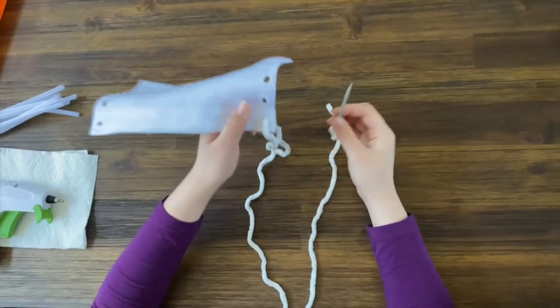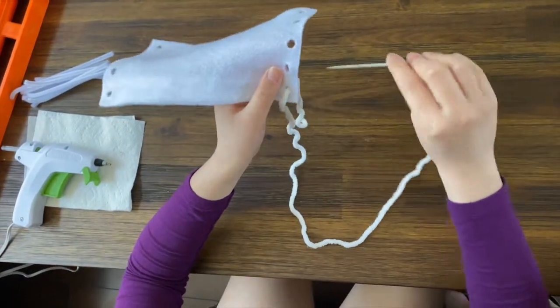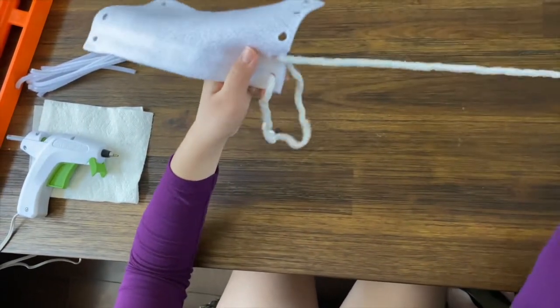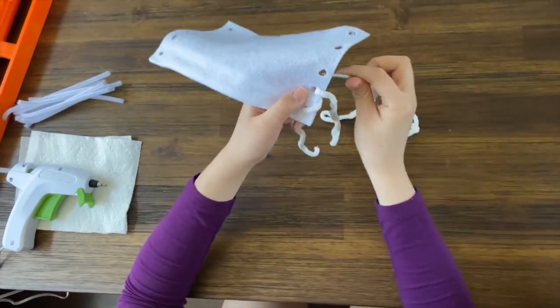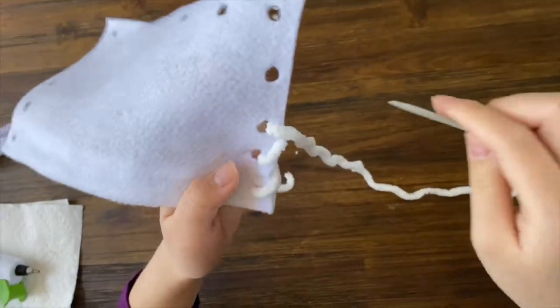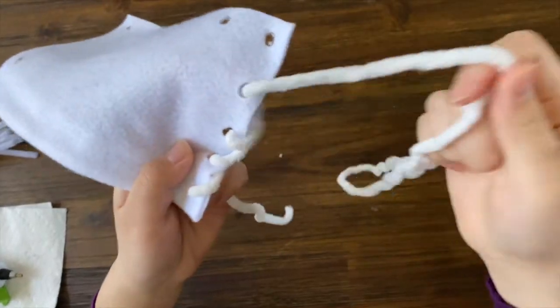So now after you have left the 6 inches out, you're going to come from the outside and go underneath. So it's kind of like spirals around. And then you're going to pull it through, and it should look something like that. And then you're going to go underneath again. And you're going to keep doing this until you reach the second to last hole.